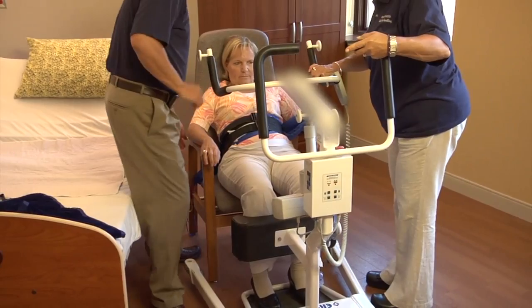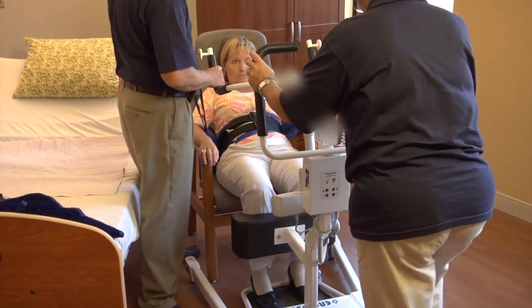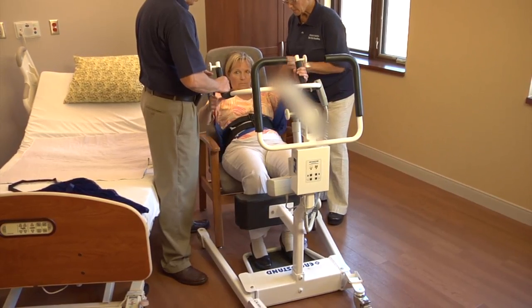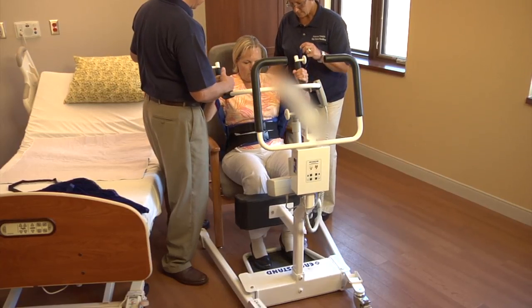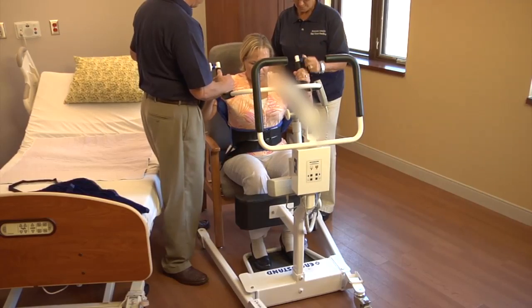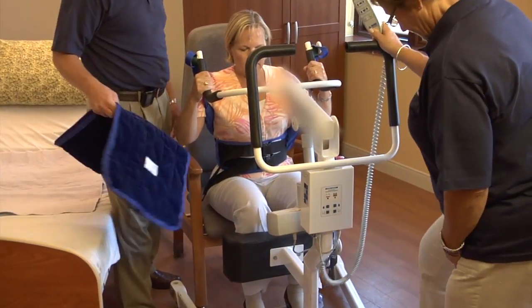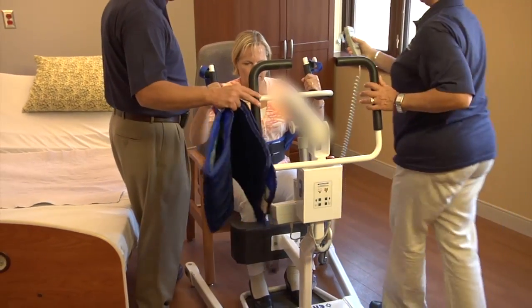In this video clip, we're going to use a device called a one-way slide. There's many different types on the market. And this is an example of a device that helps us keep a patient stable in an upright position, and it prevents that continuous sliding that some patients have. When you assess a patient out of bed, you want to make sure that you understand their out-of-bed tolerance, what's the best way to position them, what's the best way to provide pressure relief, and then you also have the option of preventing sliding using a one-way slide.